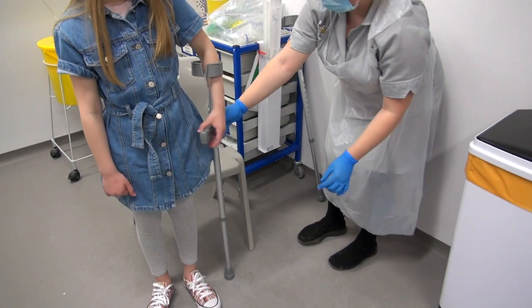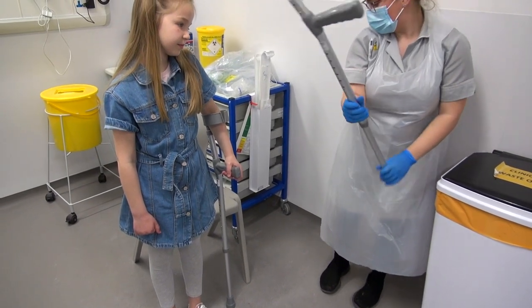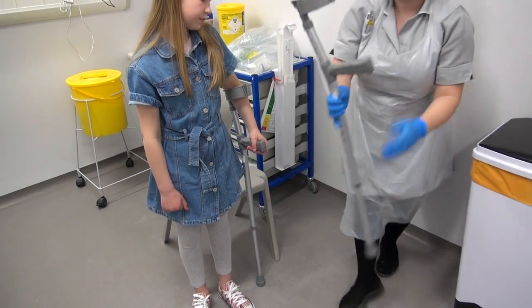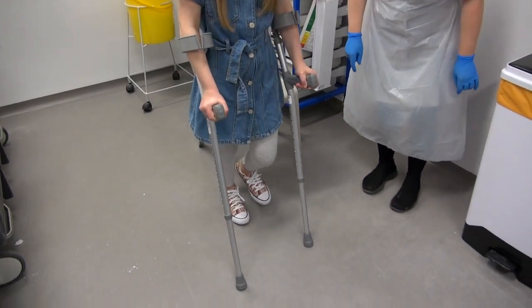Put your arm in. Perfect. We'll just measure the other one up. Okay, pop your arm in. Super. That's it. And then just hop to the crutches.